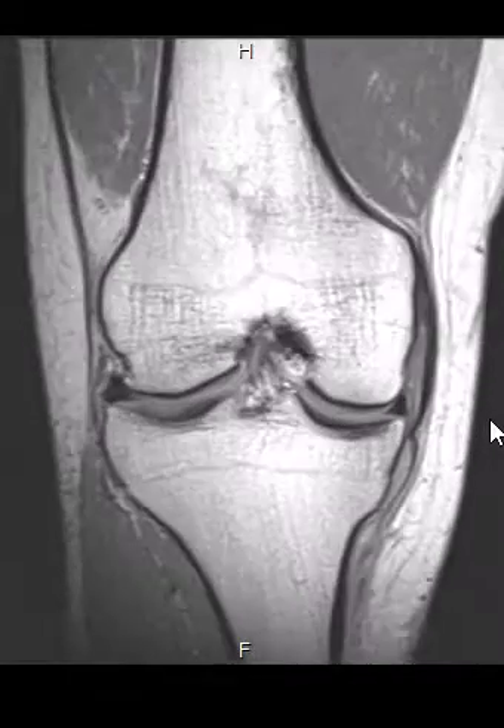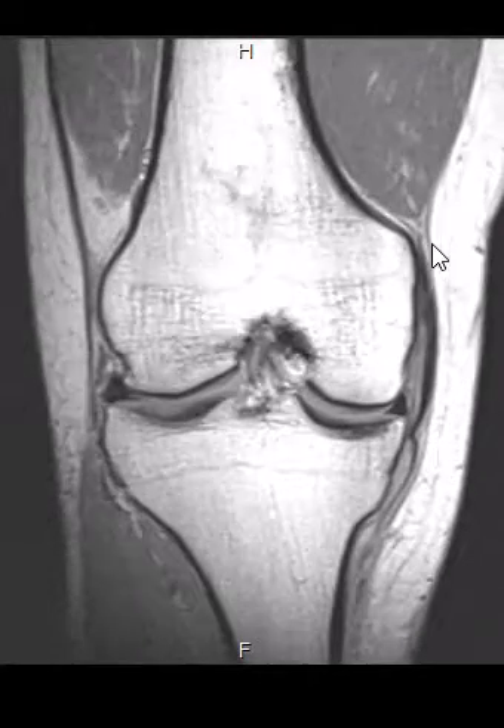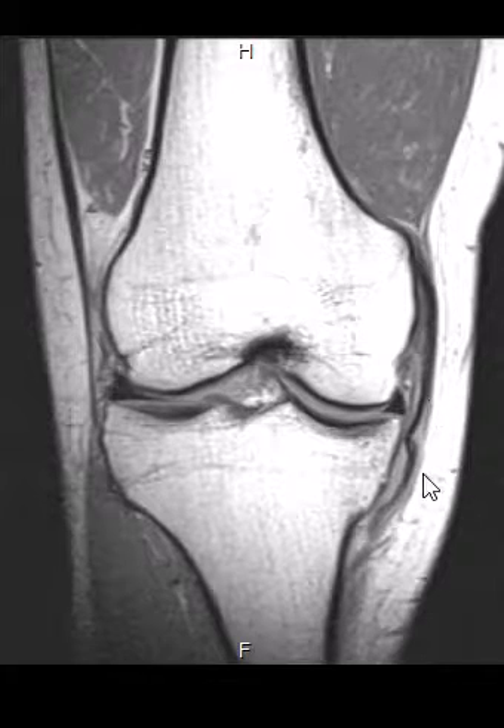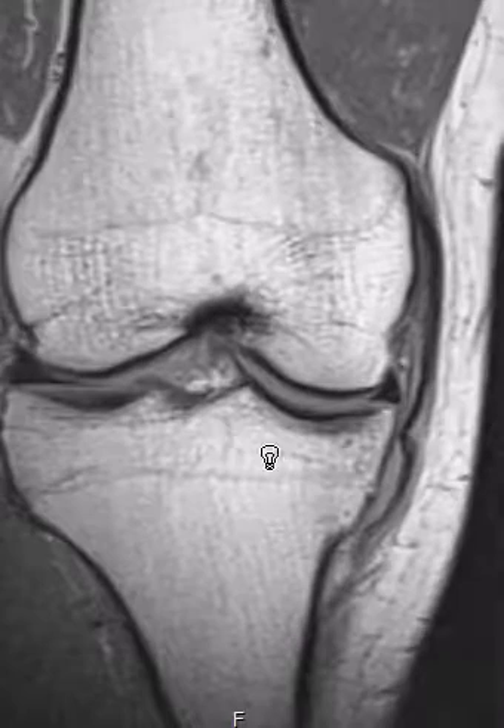On the medial side, we have the medial collateral ligament as a single structure. The MCL, or medial collateral ligament, has thick outer fibers and thin inner capsular fibers. I'm going to zoom in on this.